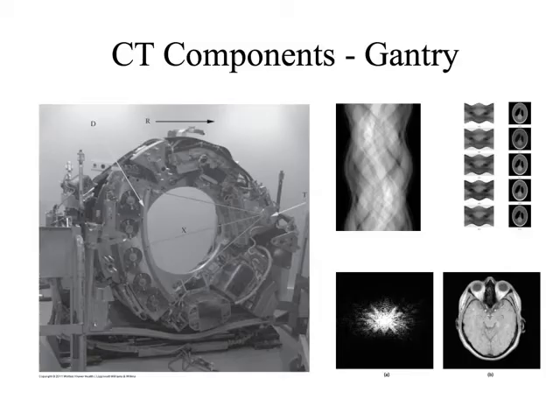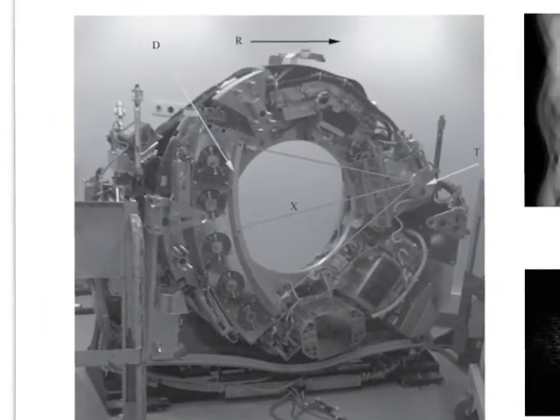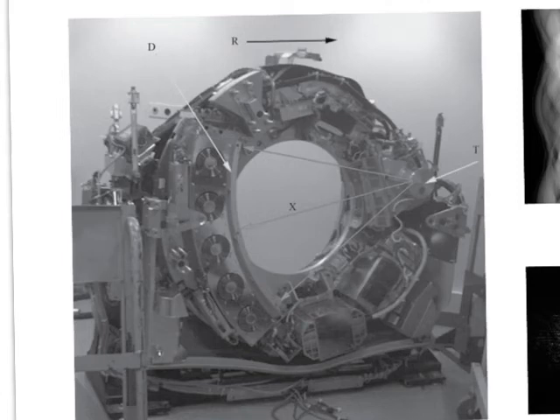I think that's cool. And I also think this thing is cool because it looks like the Terminator. This is a CT gantry without the protective coating, and bear in mind this thing is spinning really fast. I don't know precisely how fast this machine turns, and we have an indicator to tell us which direction our crazy turntable is going to be turning. But it could be upwards of, I don't know, 300, 400, 500 times a minute. So it's spinning very, very quickly.